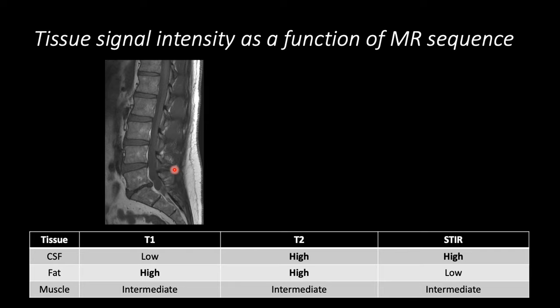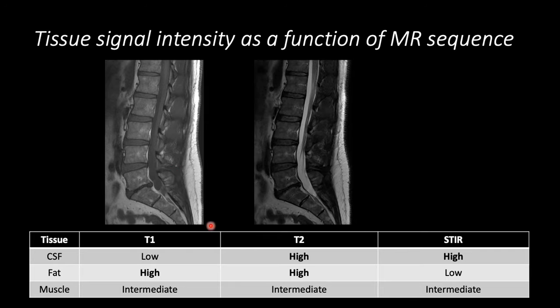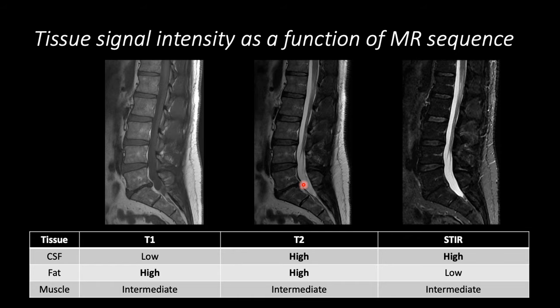Muscle is of intermediate signal intensity between CSF and fat. T2-weighted sequences are similar to T1-weighted sequences in that fat is bright in signal and muscle is relatively intermediate. However, in this sequence, CSF is bright. On the STIR sequence, the CSF remains bright. However, the signal intensity of the fat as well as the signal intensity of the bone marrow becomes dark, and this highlights areas of edema within the bone marrow.